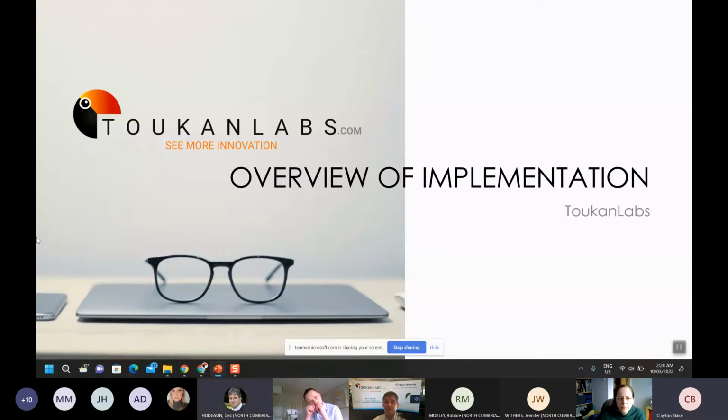There are internet versions of OpenEyes that are being used. For instance, Scotland release all theirs on the internet because they want all the optoms to connect to it, so those optoms aren't behind their secure firewall. But the version that we're proposing for yourself is behind the HSCN. So there's no direct access to the internet unless you create an HSCN gateway, which is out of scope for this. Yeah, no, that's fine. It does make it slightly easier. There's more stuff we need to do if it's an internet hosted service.